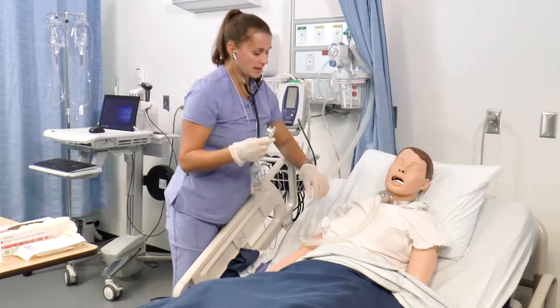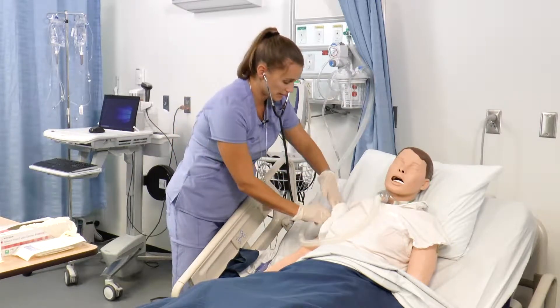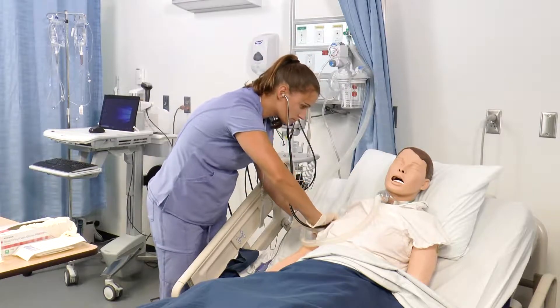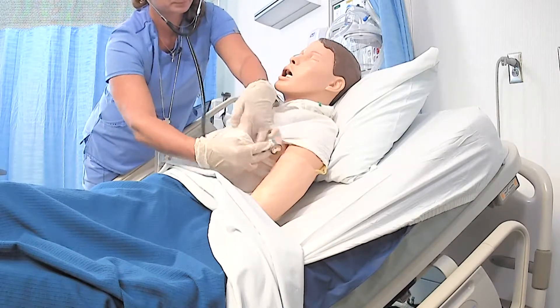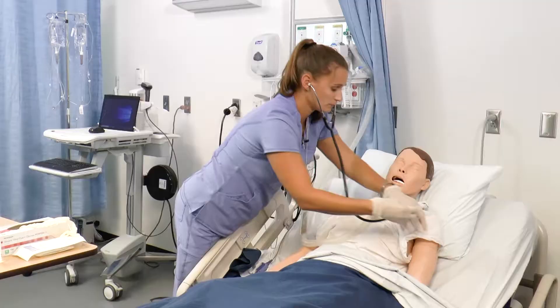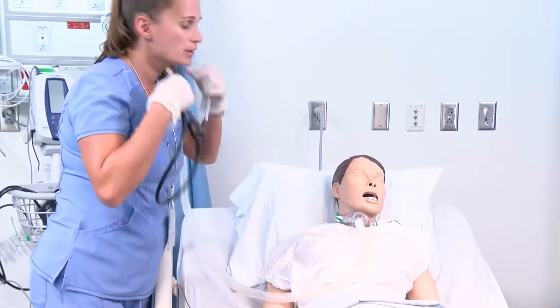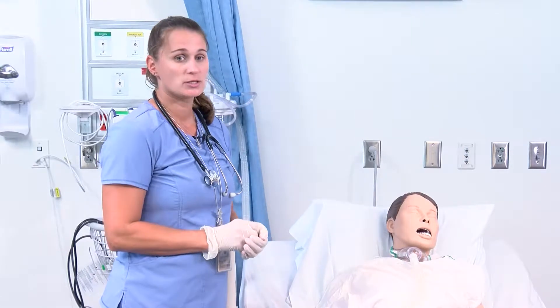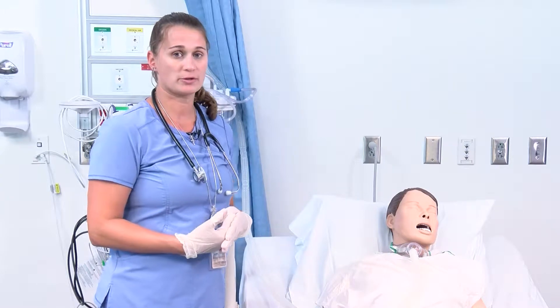What I'm listening for is adventitious sounds — I expect to hear some coarse or wet sounds. I would also listen to the back of the patient. I want to make sure that I'm not performing this skill if the patient doesn't need it, so make sure that when you're assessing your patient, the assessment lines up with the order that you received.